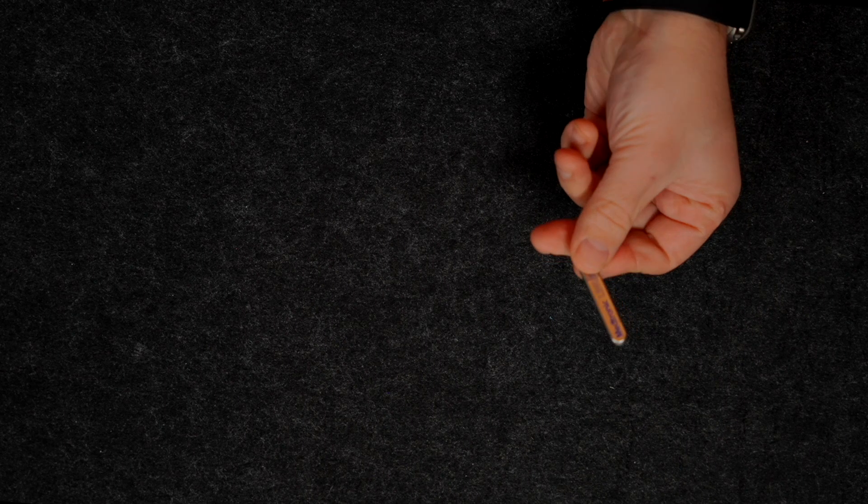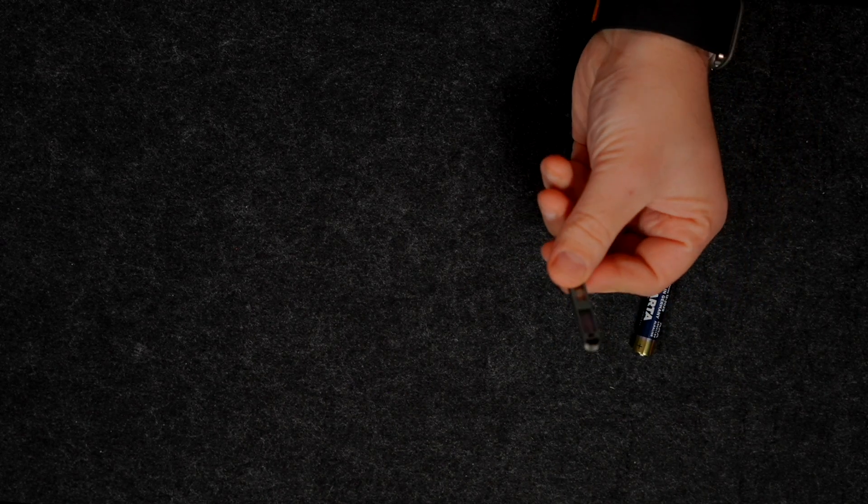A Loop Recorder is an implantable device, so it's an invasive procedure — minimally invasive I would say. However, it is an invasive procedure that requires the implantation of a chip under the skin. This is one of the more typical devices here, by a company called Medtronic, and essentially this is how small it is. If I contrast that to a AAA battery, you'll see how actually small it is. It's a chip that nowadays is Bluetooth compatible and sits beneath the skin and can stay there long-term.